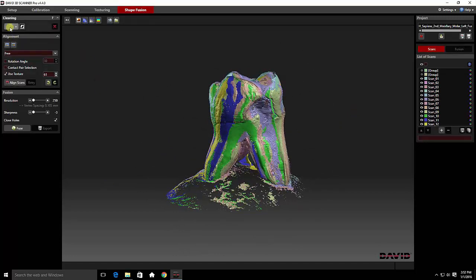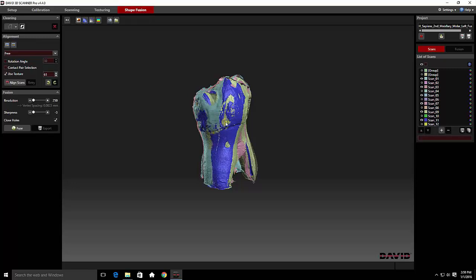We have all of this base at the bottom that's making it difficult to see anything, so we need to clean. Click on the polygon tool, then left-click on the field. Right-click around the area that you want to clean and just do a bulk cleaning — nothing really refined right now. Just clicking on spots. When you're ready to stop, right-click to highlight everything red, and delete the triangles. What we're looking for is an image that has a nice porosity to it and very little streakiness.